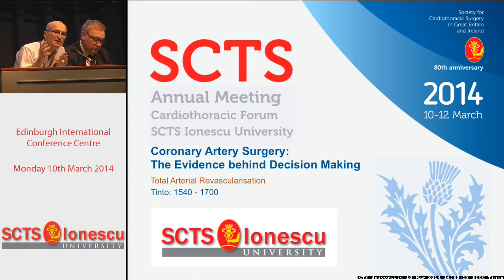And the more arterial reconstructions you do, you know that on one hand, the trade-off is potentially better long-term outcomes. You equally know that that is a technically more challenging operation. It's easier for it to go wrong. So does it make sense, if you've done 3 or 4 arterial grafts, to make sure that these are patent before a patient leaves the operating room?